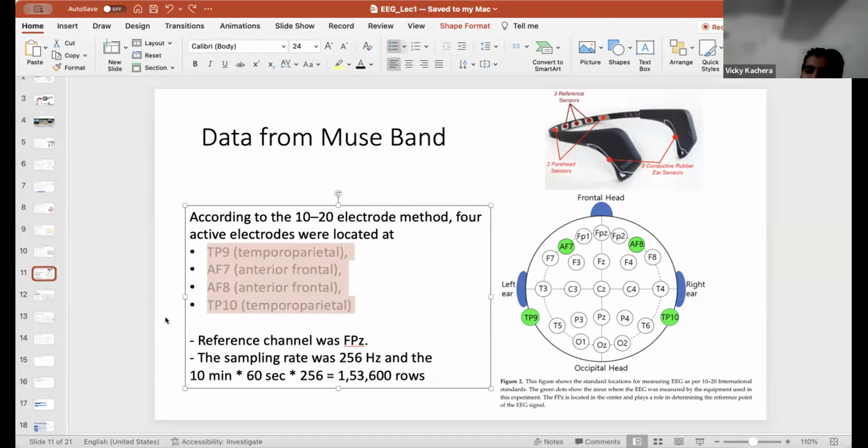The 10-20 basically tells the distance between the electrodes, right? The percentage distance between the electrodes, yes. So if there's 10% distance between the two, then 20% between these two, 20% between these two, 20%. You can see, right? So it is already set in the cap. We don't need to do anything with this. If you're not using a cap or cap fabric, then it's very hard. Then you have to measure, and no one wants to do that. But you can see here, 10% difference, 10%, 10%, and 20%, 20%, and again 10%.